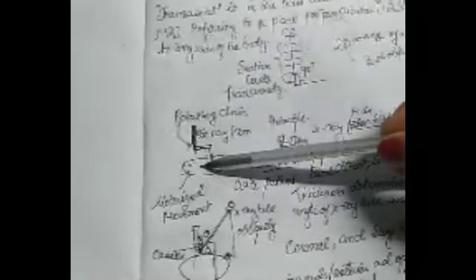So how is this rotation achieved here? This is achieved by a motorized movement supplied by AC current, and that is why it is known as electromotorized movement. With the help of the electrical supply, this will move in a circular direction and create your image. So how does the thickness of the image depend here? The thickness of the image will be determined by the angle of exposure.